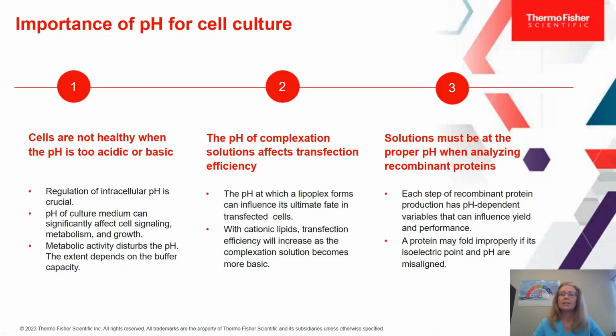Reason 2, nearly everyone who works in cell culture will also do transfection. However, the effect of pH on lipoplex formation and transfection efficiency may not be widely known. For example, in a 2021 study, the use of alkaline pDNA solution allowed more pDNA bound to cationic liposomes to enter the cells.